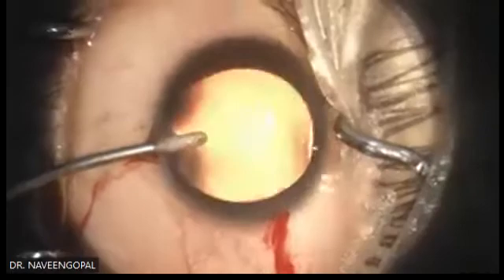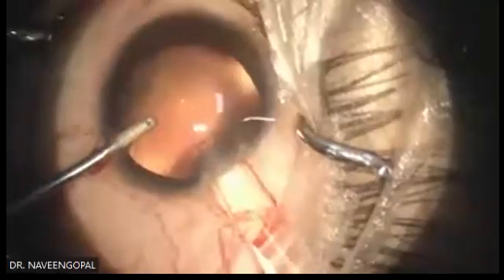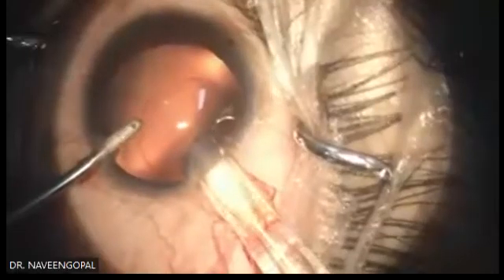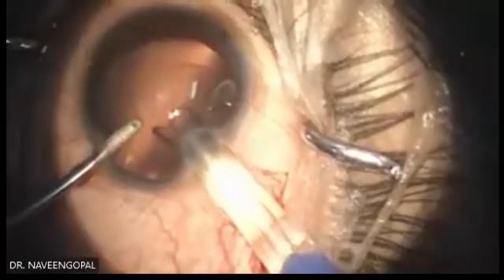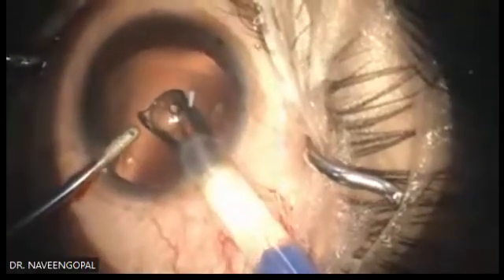I just stabilize my globe. Counter pressure can also be put, counter pressure and with pressure. Now the lens is going in. You put it very slowly. Now the lens is opening. Wait till the lens opens. Here at the half point, wait till the lens opens.